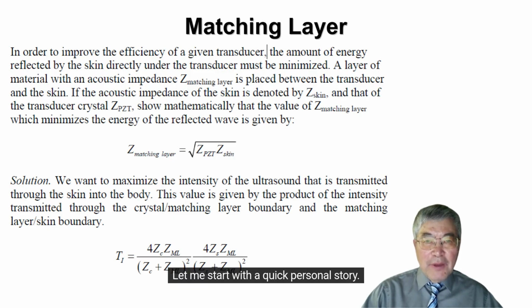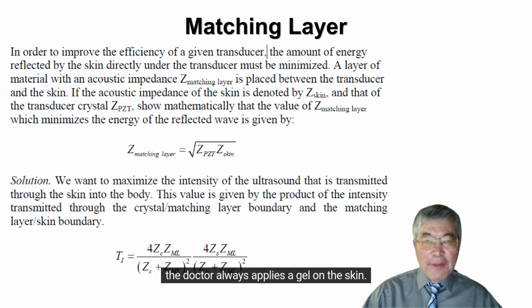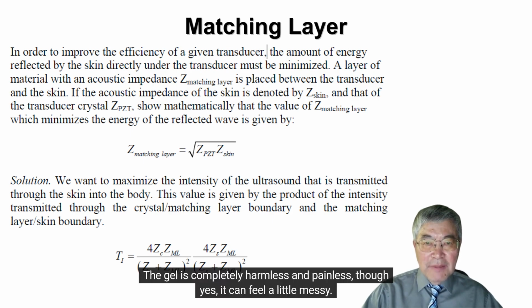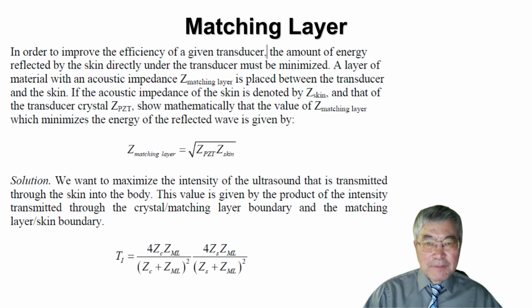Let me start with a quick personal story. I once mentioned that I had a kidney stone, and when you go for an ultrasound scan like that, you'll notice the doctor always applies a gel on the skin. The gel is completely harmless and painless, though yes, it can feel a little messy. But that gel is doing something very important. It's not just for comfort or for better contact. It actually helps solve what we call a matching problem.